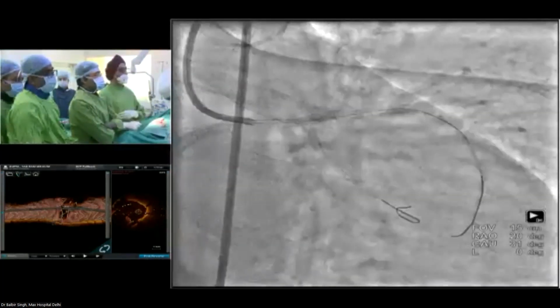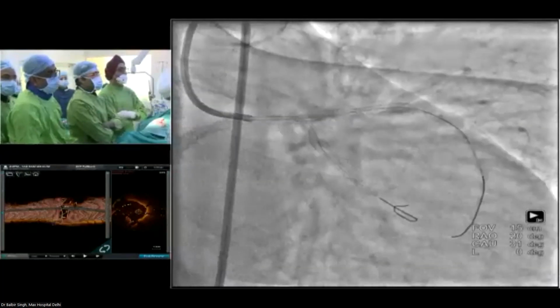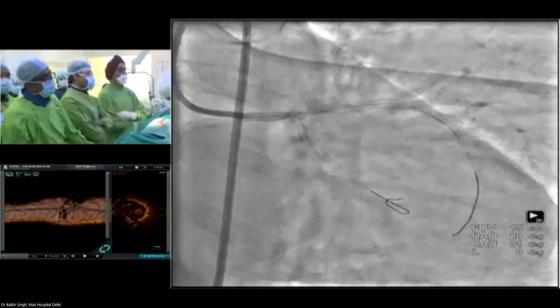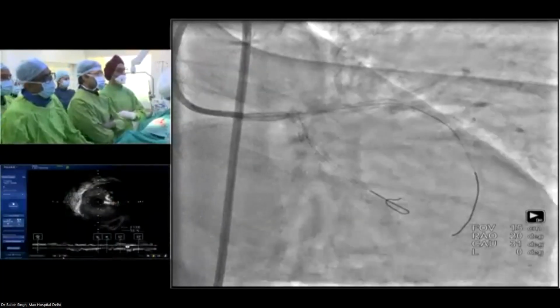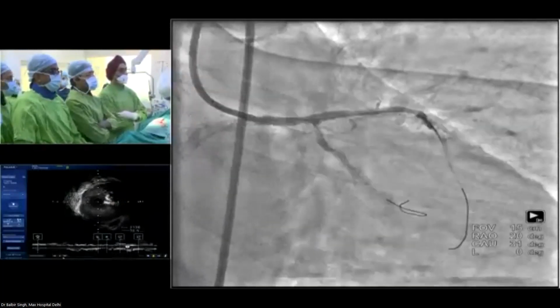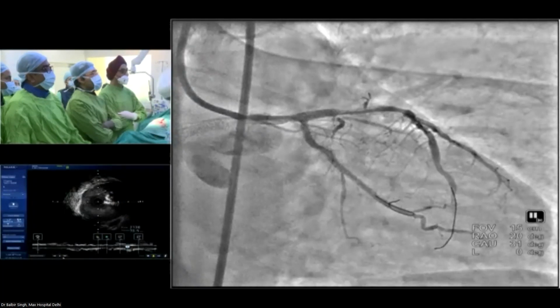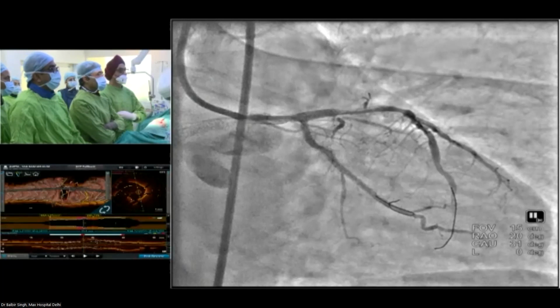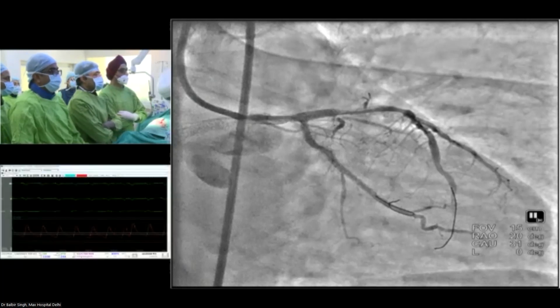So you can see at the distal part of the left main, there is under-expansion of the stent. Obviously, I had gone on the low atmospheres. So if you ask me, I think I personally would choose here an Onyx stent, because it's the easiest way to recross through the struts. However, you are a very experienced operator, so you will also be able to recross. But I definitely think final proximal optimization is now needed. Okay, so next.